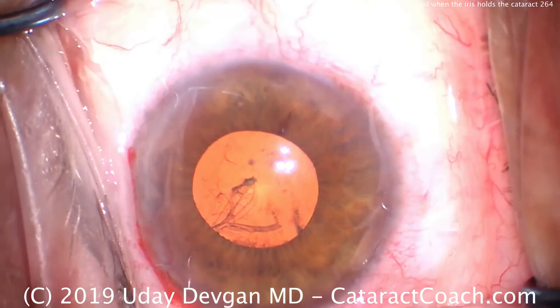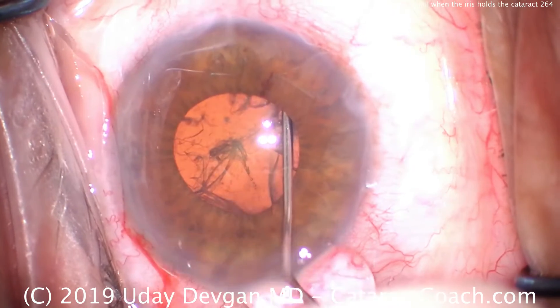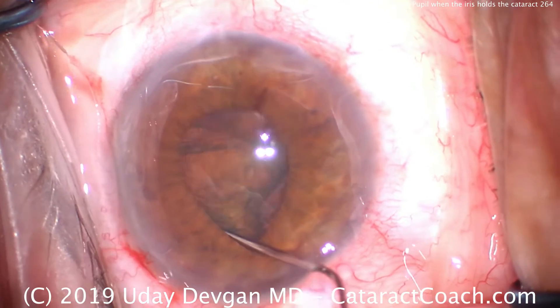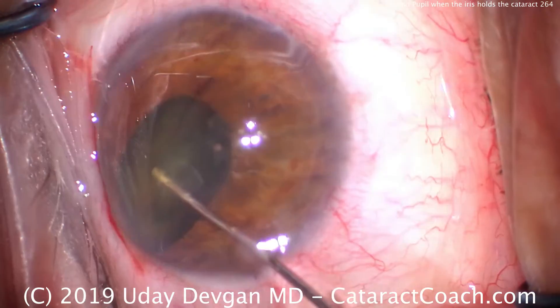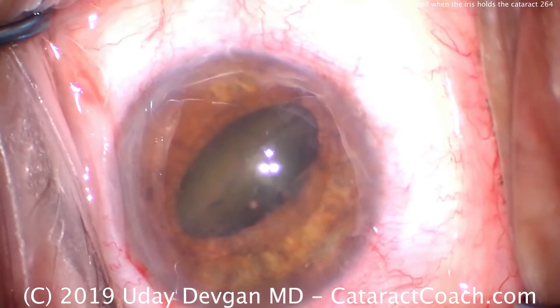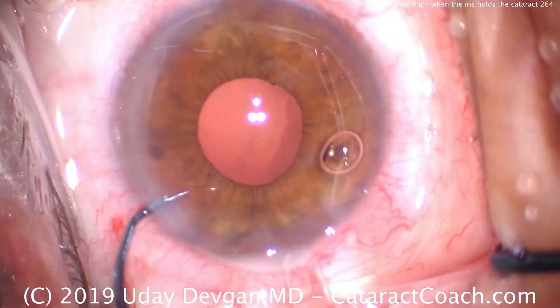Here's how we get the nucleus out of the bag. The key is to be slow and steady — do not be forceful or fast. A little bit of fluid; once you get the fluid wave, keep injecting, and there the nucleus comes out of the bag. Now using the cannula, just dig into the nucleus and tilt it up exactly like that. Now you have the pupil and the iris holding the nucleus, and it can be emulsified quite easily.